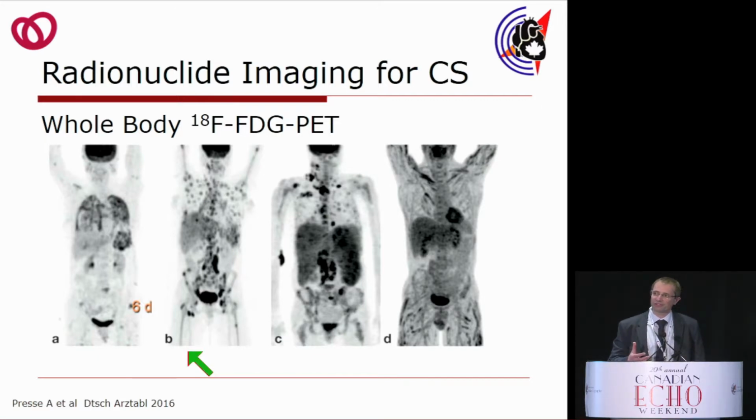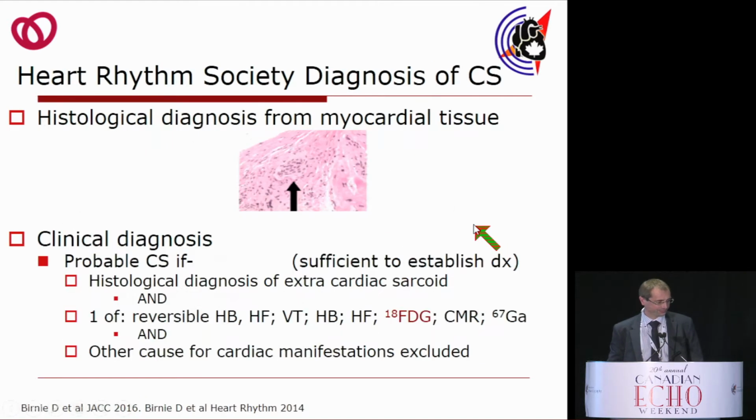This is 4 different patients with sarcoid. And the patient on this side here primarily has lung and splenic involvement. This patient, all these dots, is sarcoid granulomas within the bones. So this is mainly bony sarcoid. This patient here has uptake in the lymph nodes around the celiac axis, the mediastinal nodes, and also within the spleen. And then lastly, this patient here has skeletal muscle sarcoid as well as cardiac sarcoid. So it can affect different patients in different ways. I put this up partly so that you didn't ask questions about it and that we had a reference point.